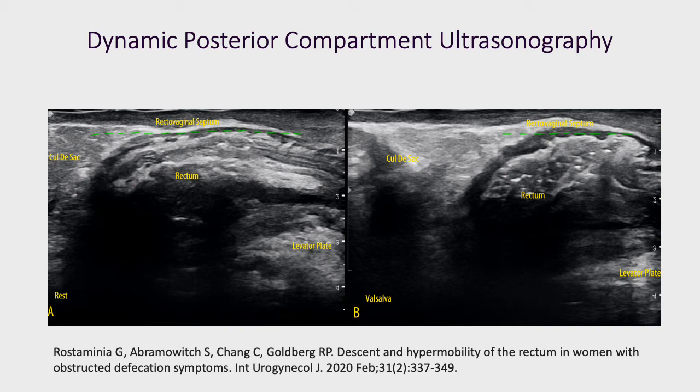This patient shortens the distance between the cul-de-sac and the levator plate on Valsalva. This phenomenon is called rectal folding or rectal sliding and is associated with decreased attachments of the rectum and increased rectal mobility.